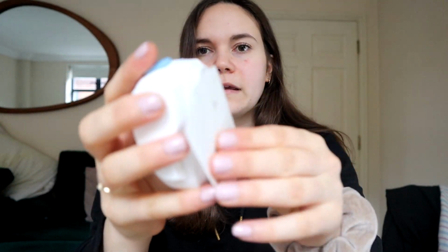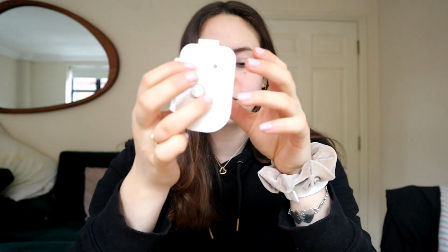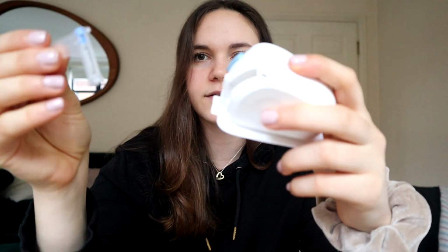So you have the application insertion device, and this is the bit of adhesive where it sticks to the skin, and this is what holds the pump to your body, and then this is the needle which is going to insert the cannula. So you have to line up these two together. There's a hook at the bottom, so you hook the bottom of the stickers onto there, and then the button goes through the middle, and then push it through. So now the sticker and stuff is all together. There's a hole in the top here, and you have your cannula, so you insert this with the bottom in and then click it in.